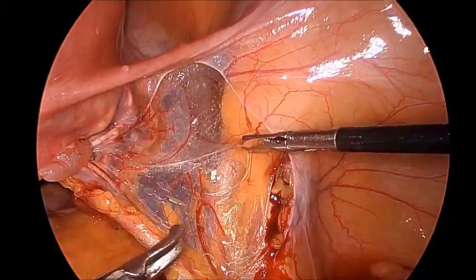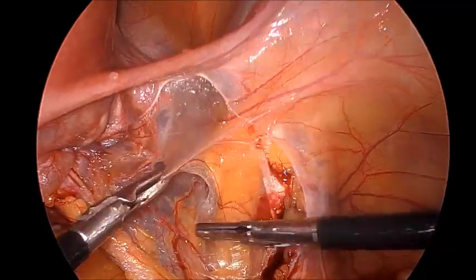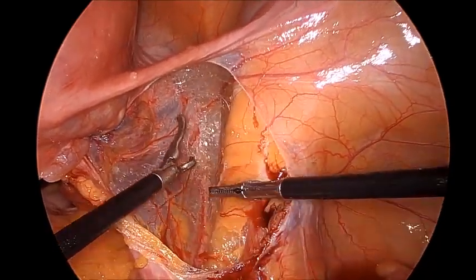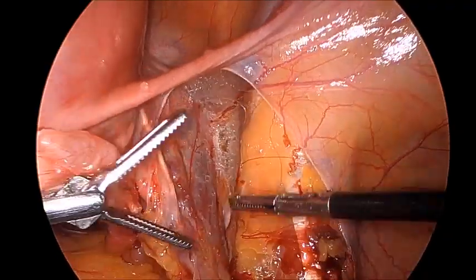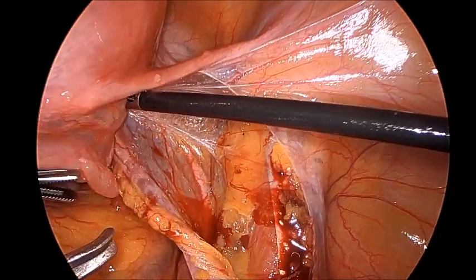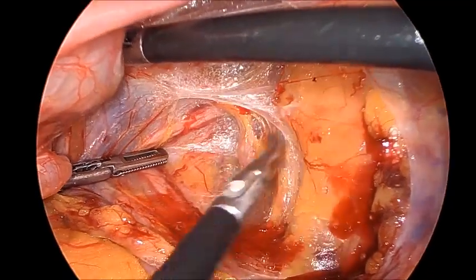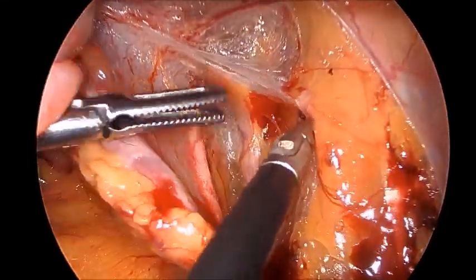First and foremost, our priority would be to identify the ureter. So how do we do that? We try to use an atraumatic grasper and we push the ureter medially. When we do that, you can see a white glistening structure with a network of capillaries on its surface, and that is your ureter. Characteristically, you can appreciate the peristaltic movement of the ureter. This is how you identify the ureter.